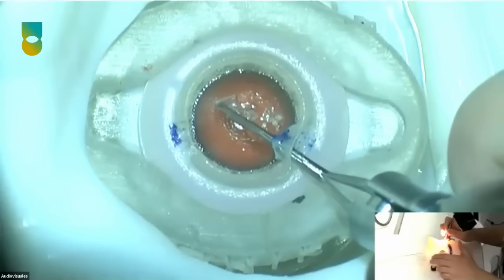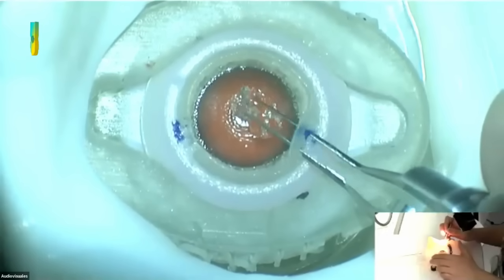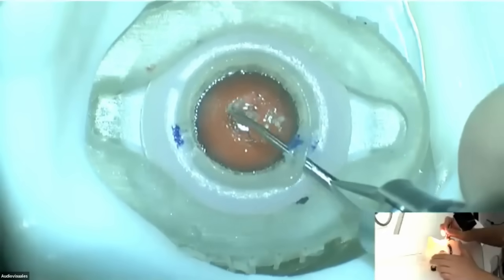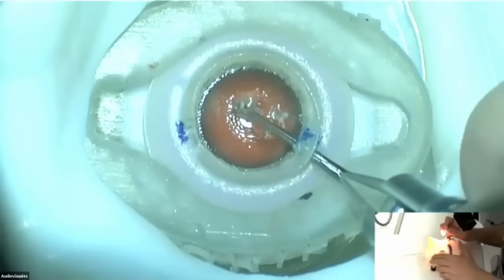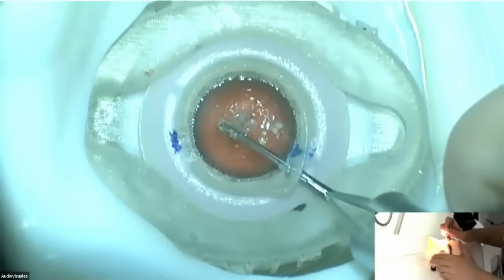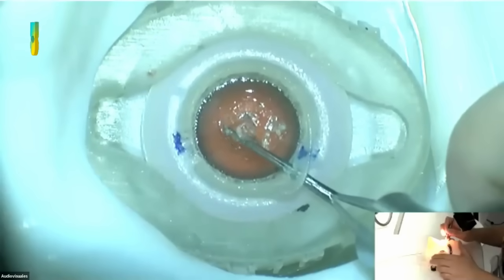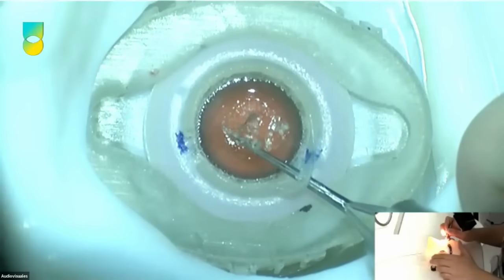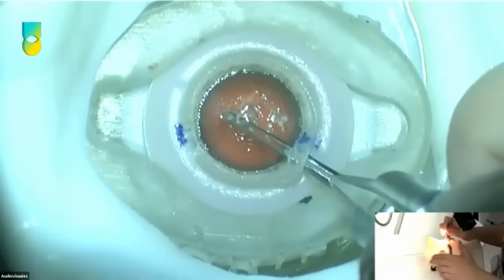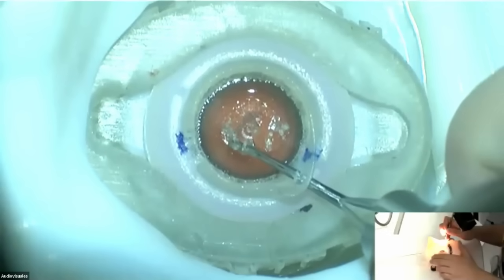One, so that you're not creating any disruption for the wound. And two, so that you're not burping viscoelastic out of the eye. Because again, you really want that anterior chamber very stable. And so you want to have a nice kind of pressure there so that as you're creating your capsulorhexis, you're not causing any decrease in pressure, which could lead to tears. So with the hand position, be really, really cautious to just pivot within the incision.